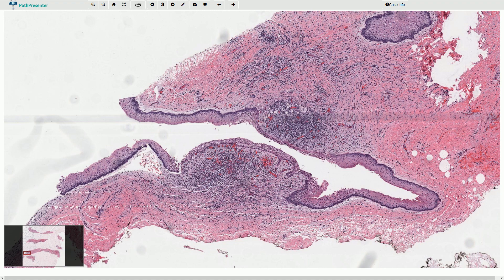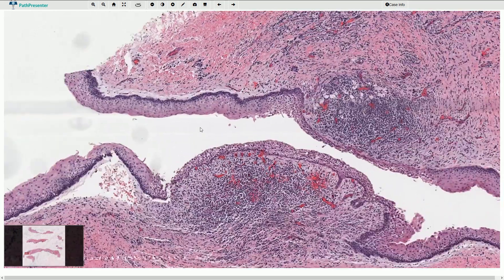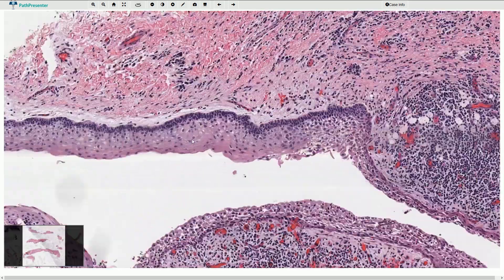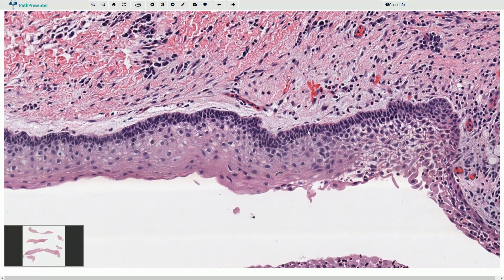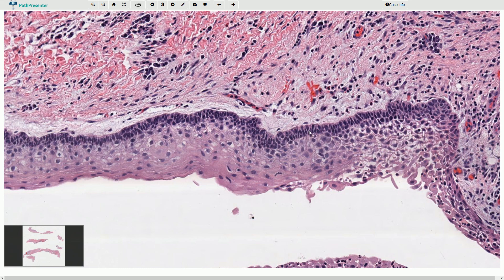We can sometimes find these artificial clefts or empty spaces. This is an artifact but it is quite a useful sign. Another important feature is when we look at the basal layer we can see that the basal cells, basal keratinocytes, are palisading — arranged in a palisade so it resembles a picket fence.